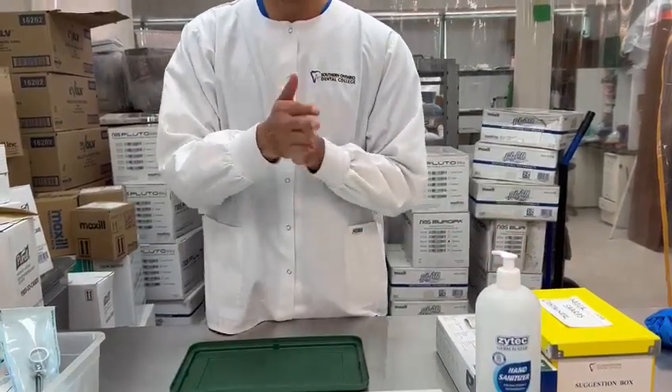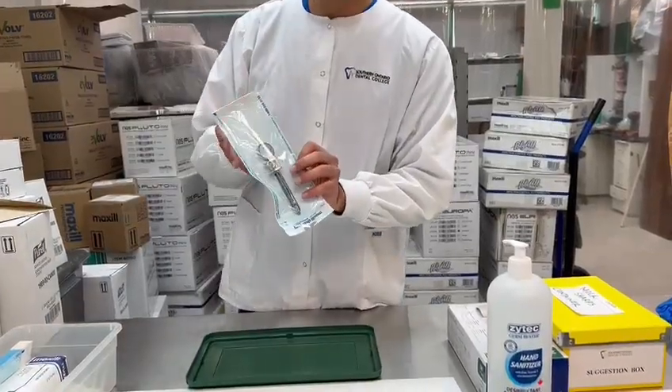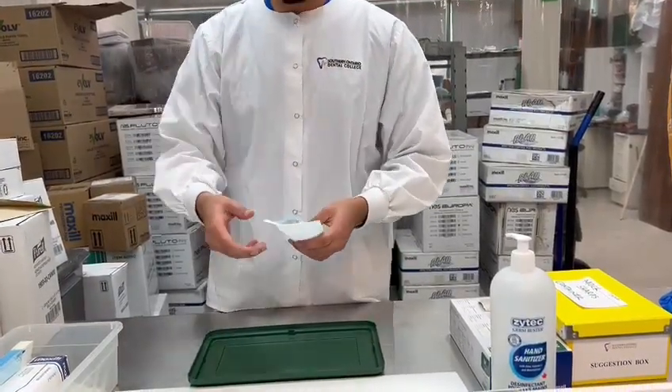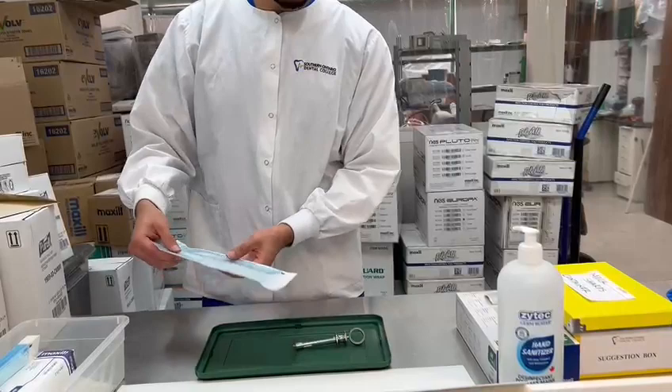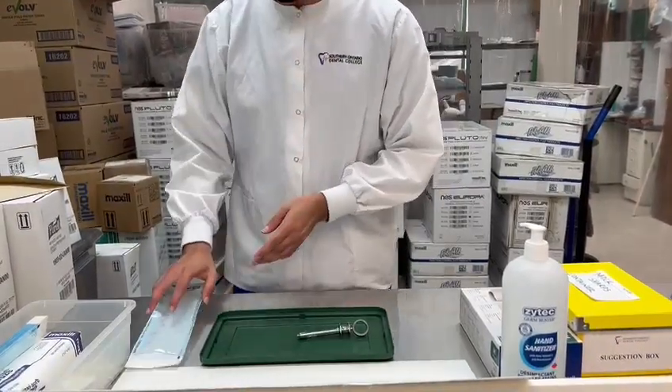We start by hand sanitizing first, making sure our hands are clean. We grab the sterilized syringe and open up the package, then drop it into the tray. We make sure we don't touch it with our bare hands and we keep this for documentation in the ROT.